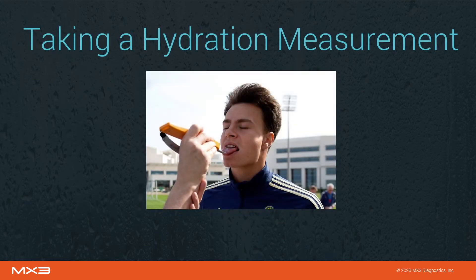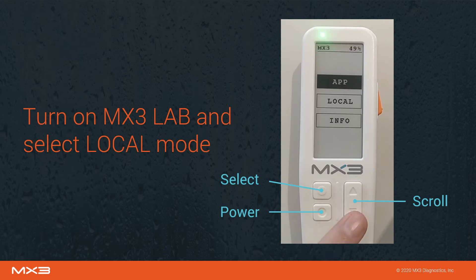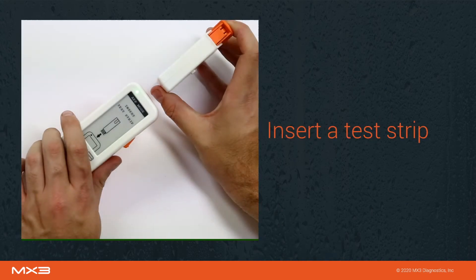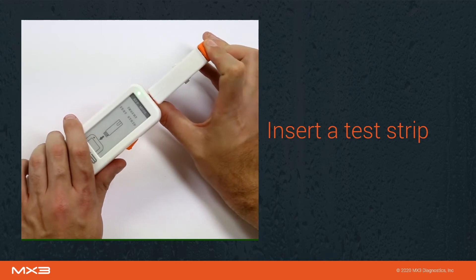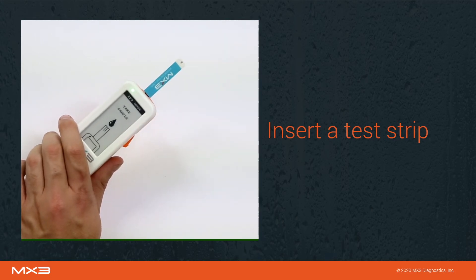We'll now go through the process of taking a hydration measurement. To initiate a measurement, first turn on the MX3 lab using the power button. Use the scroll buttons to select local mode, then press the select button. The lab will now prompt you to insert a test strip. Press and hold the large orange button on the dispenser to dispense a test strip. Insert the strip into the port on the top of the MX3 lab with the label facing upwards, then release the button and pull the dispenser away from the lab.